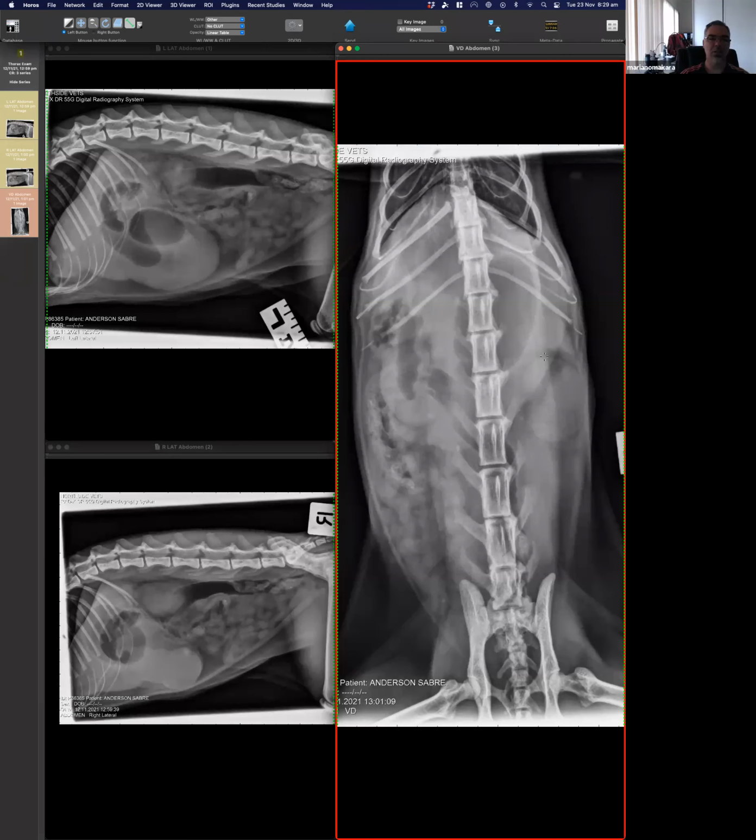Okay, I like that answer. I agree with the justification of the ultrasound. So the conversation should be something like this. There is an obstructive pattern. So there is an obstruction in the pylorus-duodenum. I think you're right.